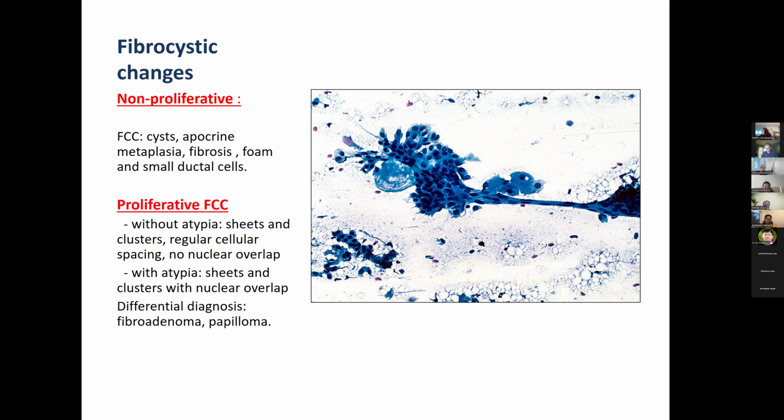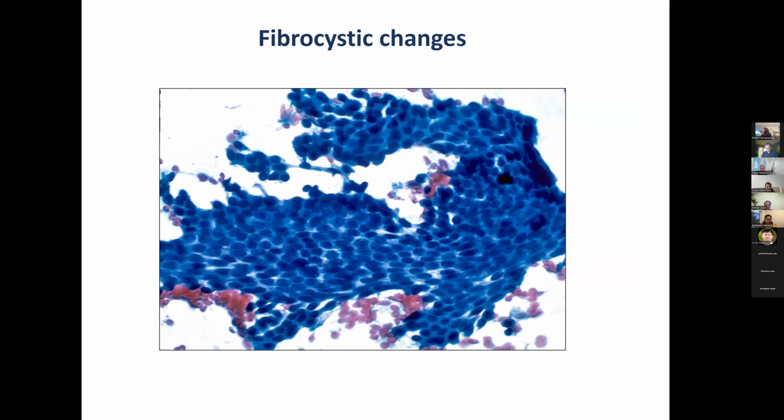The proliferative ones have a more florid ductal hyperplasia, and the risk for subsequent cancer is a little bit higher. So it's important to recognize this entity. And for the non-proliferative, you will see just the regular benign entities with very cohesive cells, and cellularity won't be that impressive.